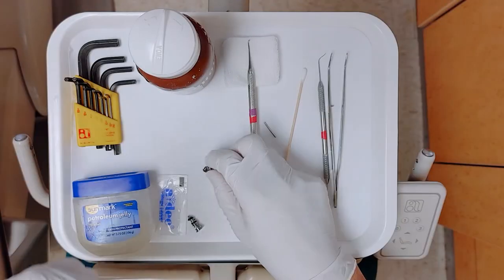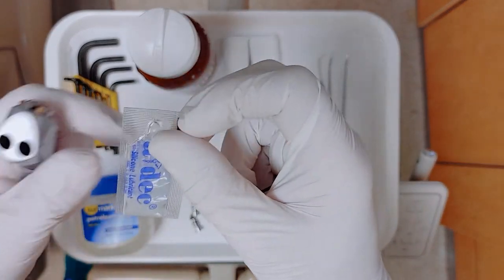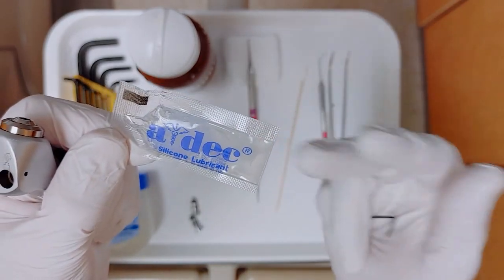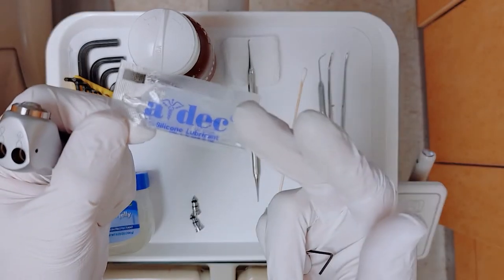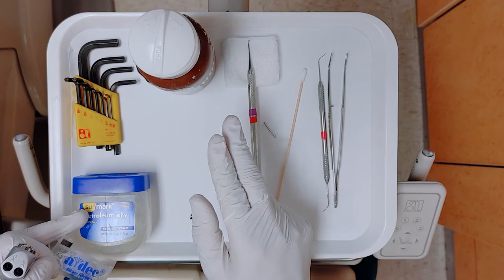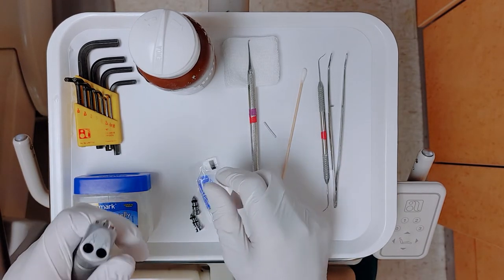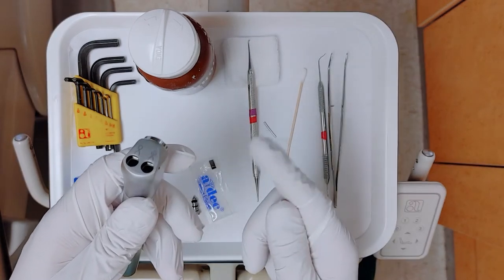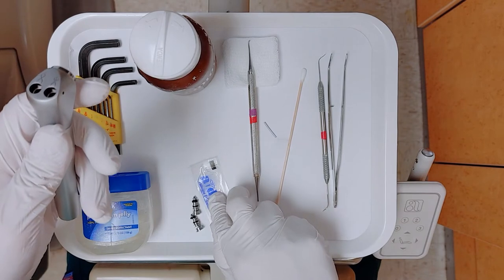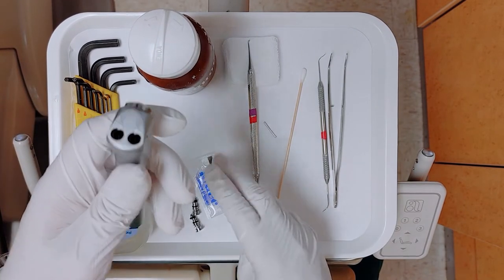If it needs to be lubricated, a lot of times with your manufacturer that you get it from, there's going to be this little bit of silicone lubricant. If in a pinch you don't have any of this, but you're going to order and get some soon, another thing that we can use is petroleum jelly, but don't use it for too long. It is known to eat away at the O-rings. So if you're going to replace the whole unit eventually or soon enough and you just need to get by, you can use that. If you have some of this spare left behind, you don't need to use a lot of it, we can lubricate with this material.